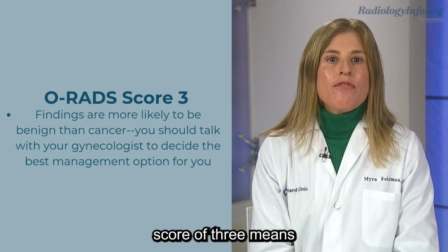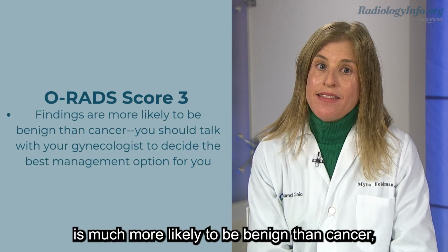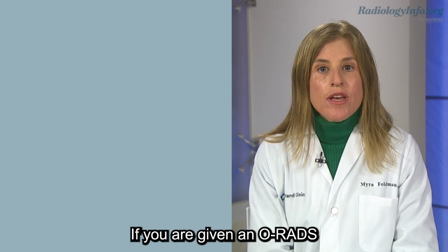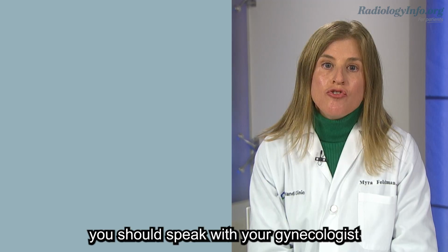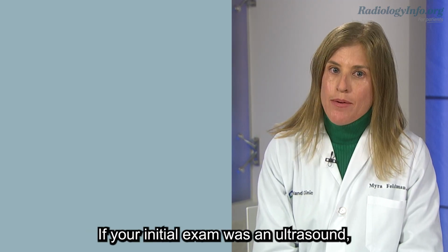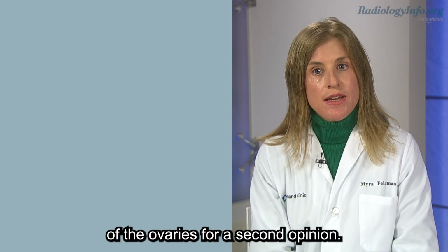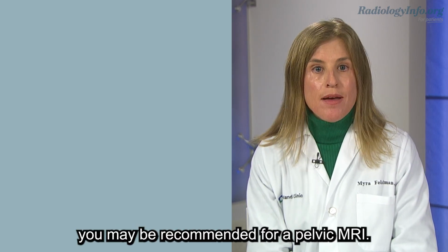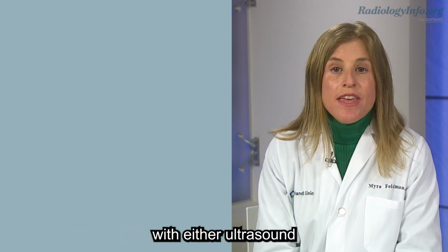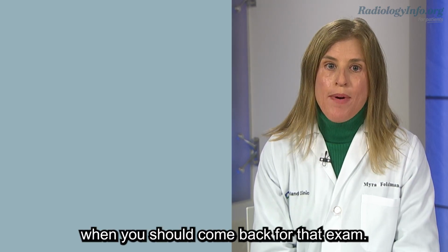An O-RADS score of 3 means the observation is much more likely to be benign than cancer, and the level of concern for cancer is low. If you are given an O-RADS 3 in your report, you should speak with your gynecologist to determine the next steps. If your initial exam was an ultrasound, you may be referred to a specialist in ultrasound of the ovaries for a second opinion. In some cases, you may be recommended for a pelvic MRI. If you and your doctor decide that monitoring you with either ultrasound or MRI is the best option, they will let you know when you should come back for that exam.